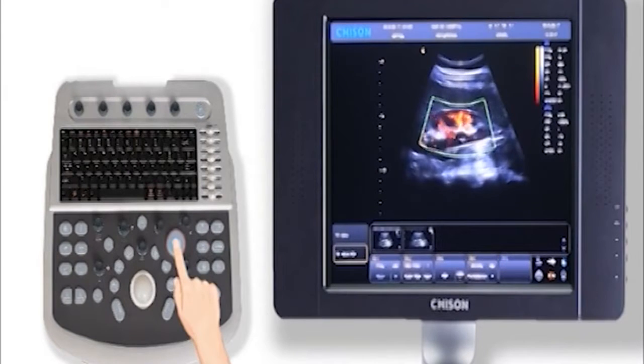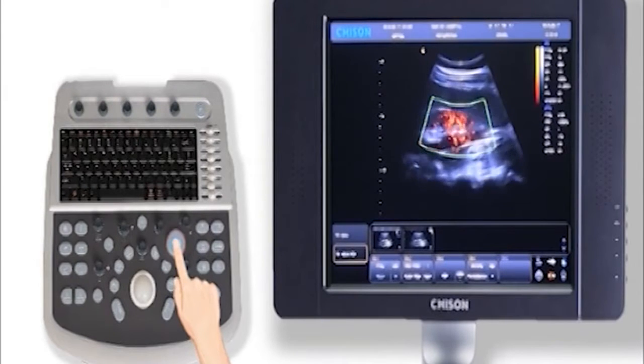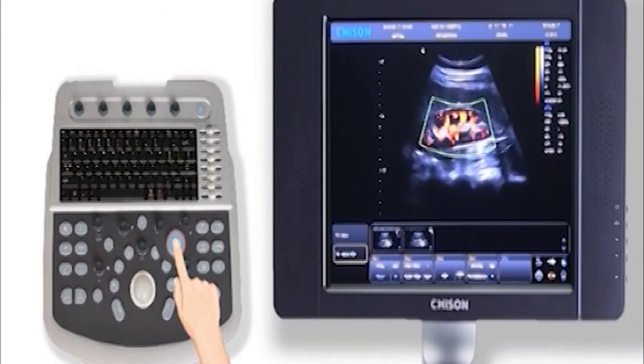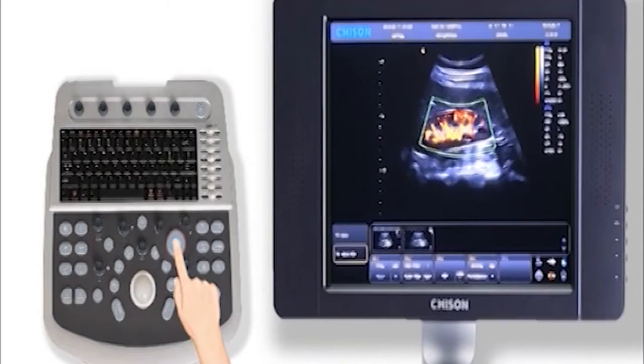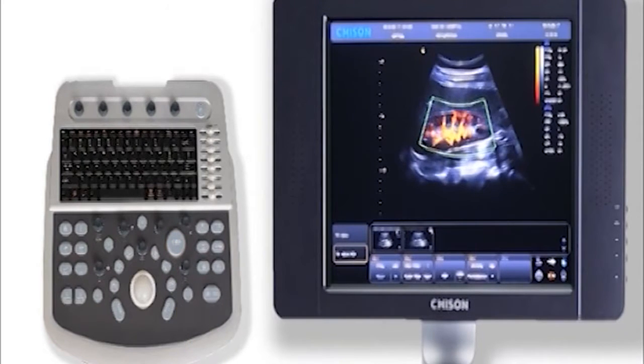Besides key C, there is a CPA button for color power Doppler. Press this button to turn this function on.